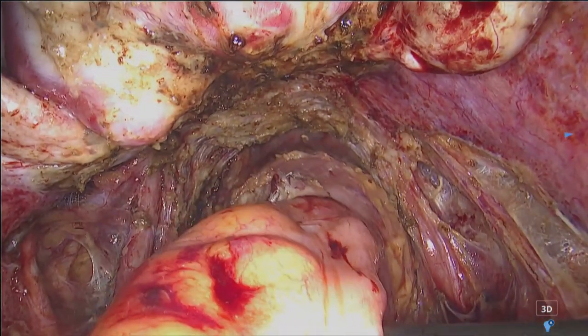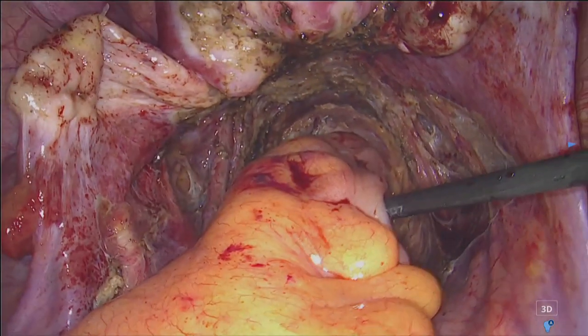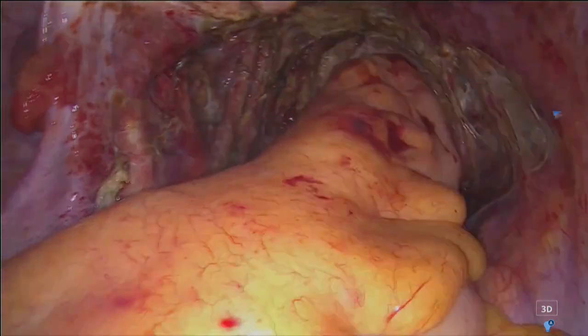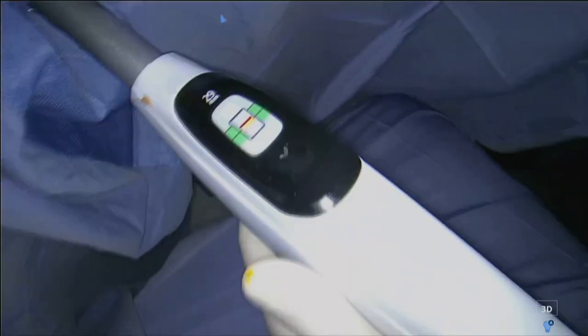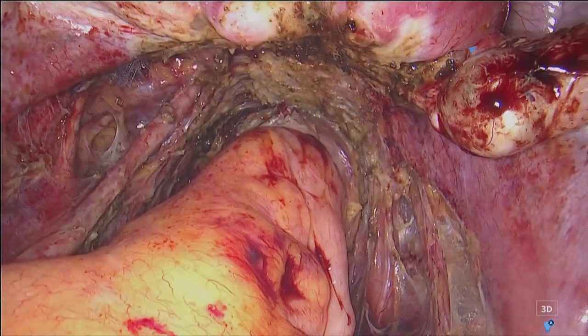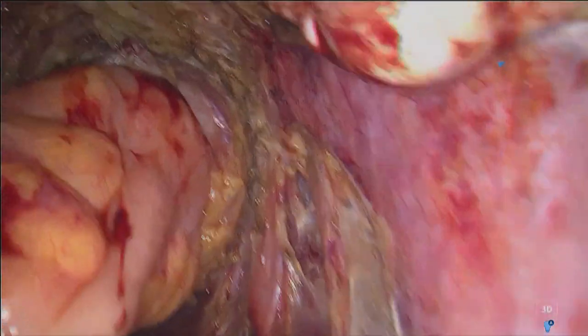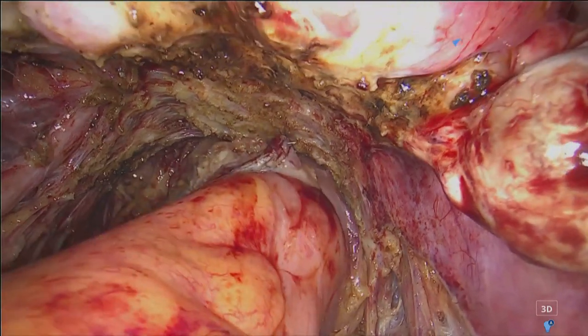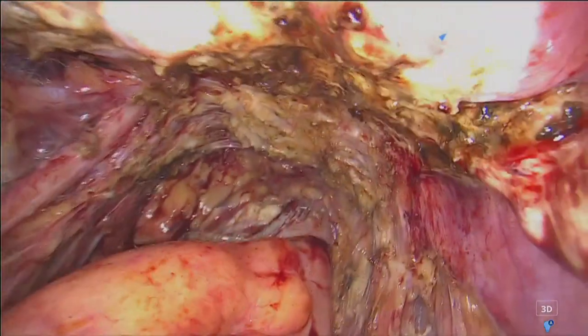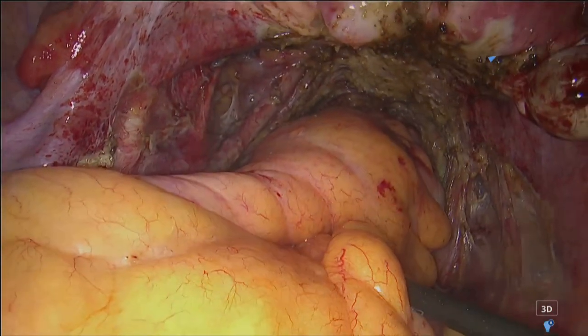Ok, I stay for at least 10 seconds to reduce the edema of the tissue, and then ready. I arrive in the green part here, in the green, in the middle usually, okay. And then I close with the circular echelon, and then I move. Then Roberto will check the two rings.